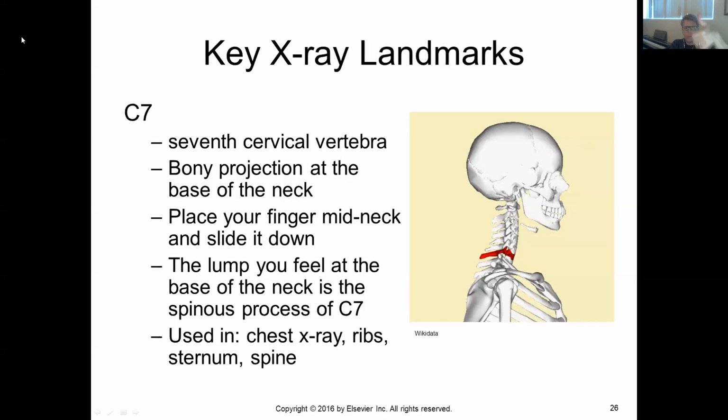So if you put your thumb on patient's C7, the span of your hand is about 7 inches. And if you really extend it, then you can get to about 8. You can measure this distance. So thumb on C7, hand extended like so. The tip of your pinky is going to be pointing at T7.